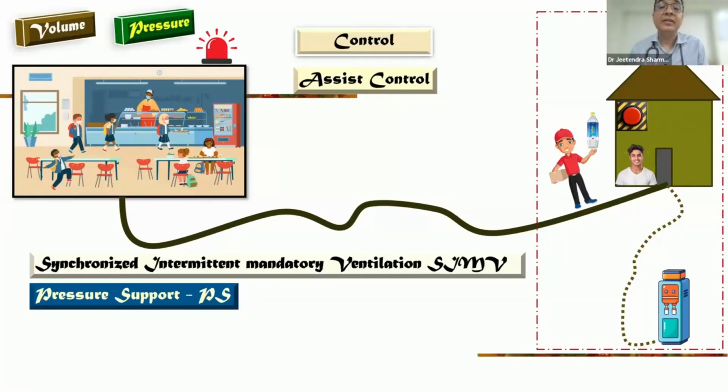What does it mean? When the backup ventilation is activated in the pressure support mode, and after that the patient starts triggering, the ventilator will not go back into pressure support. It gives you an apnea alarm all the time, apnea ventilation, and converts into assist control mode.